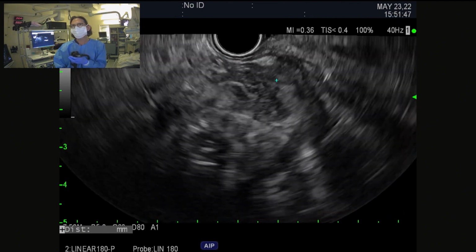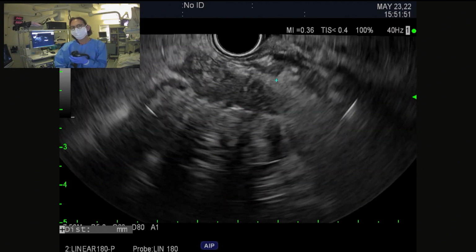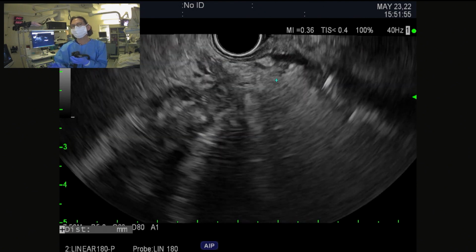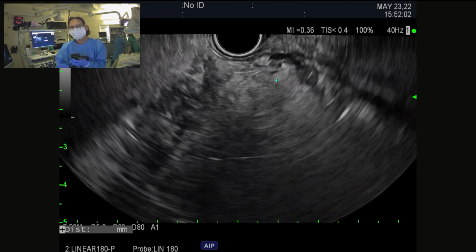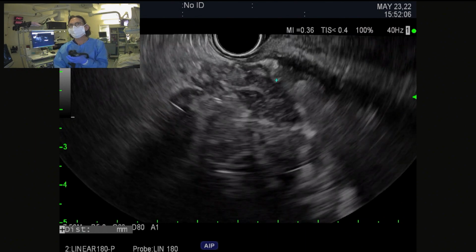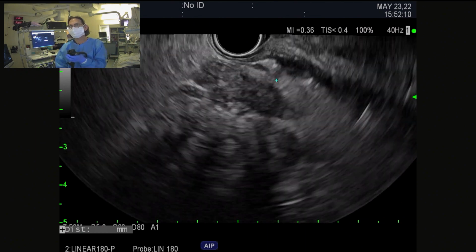And I will then have their radiologists irrigate and inject contrast, of course, to get a better definition of what the anatomy is and how extensive this is. Right now, we just have our CT scan as a guide for this. So in the interest of time, let's just get started, and we'll place the 20 millimeter LAMS.